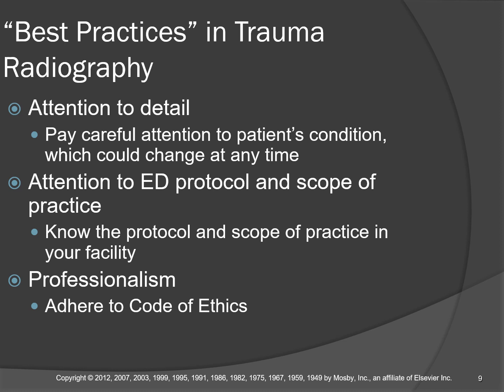Okay, there's a reason they're hooking them up to the monitors. So take a glance at the monitor every now and then. If the monitor starts alarming, you really should stop and figure out what the heck's going on with that. Know the protocol for the emergency room, for trauma, and know the scope of practice.